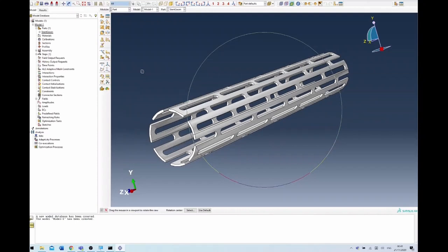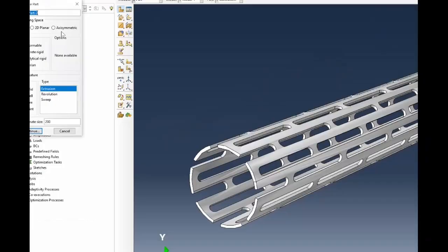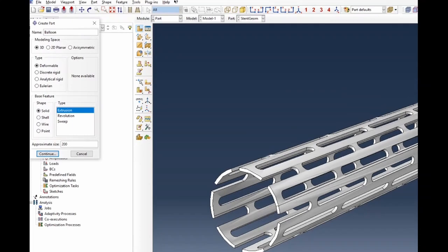The stent would have a balloon that will be expanded, so I'm going to double-click on parts and name it 'balloon.' Because it's an angioplasty procedure, it's going to be a 3D modeling space, deformable. However, it's going to be a shell because the balloon is a very thin structure, so it's best to model this as a shell. I'm going to choose to create this using a revolution, and I'll explain that to you.